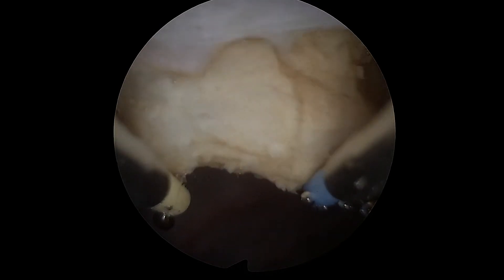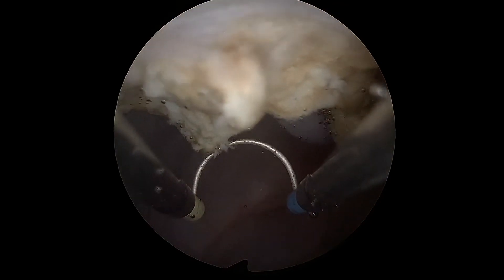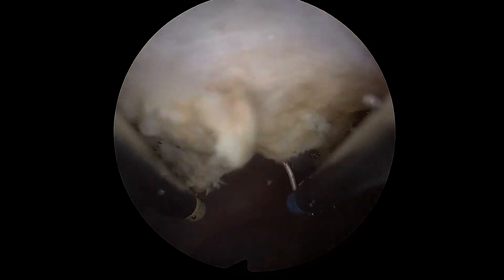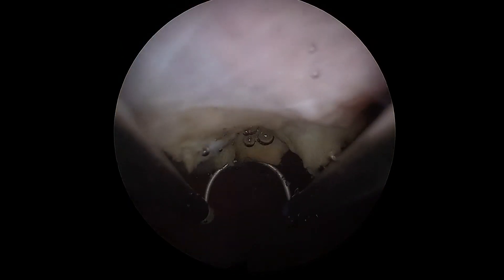As with all of Gynosim's hysteroscopic, cystoscopic, and laparoscopic real tissue models, the model demonstrated here responds normally to all energy systems.